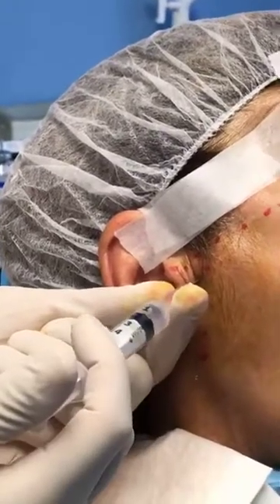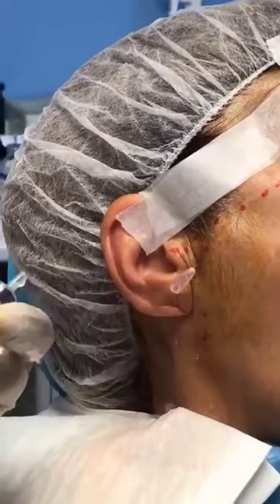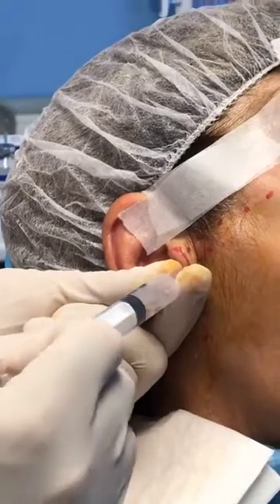Now it's clear. At first it was pink — that's why. This means that lavage works. It's not fantasy. And then at the end you just make an aspiration right there.